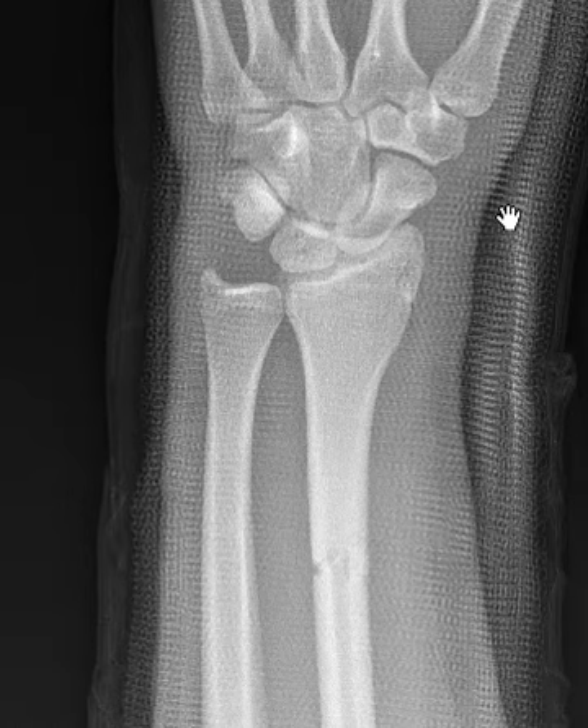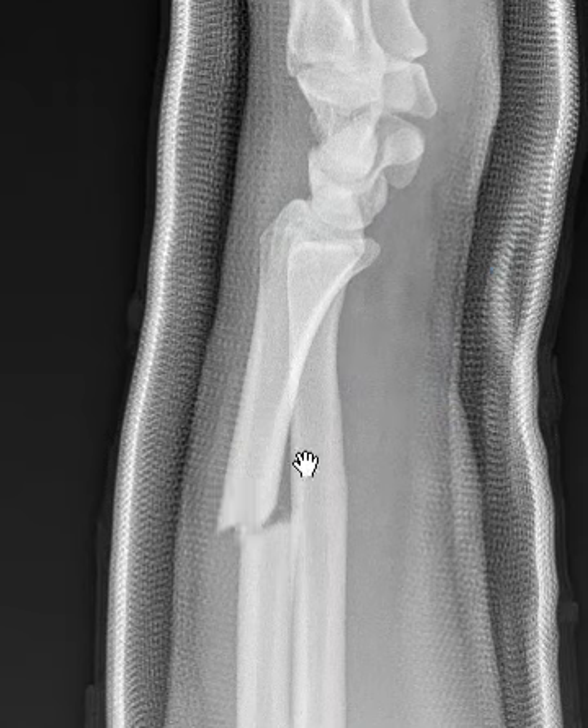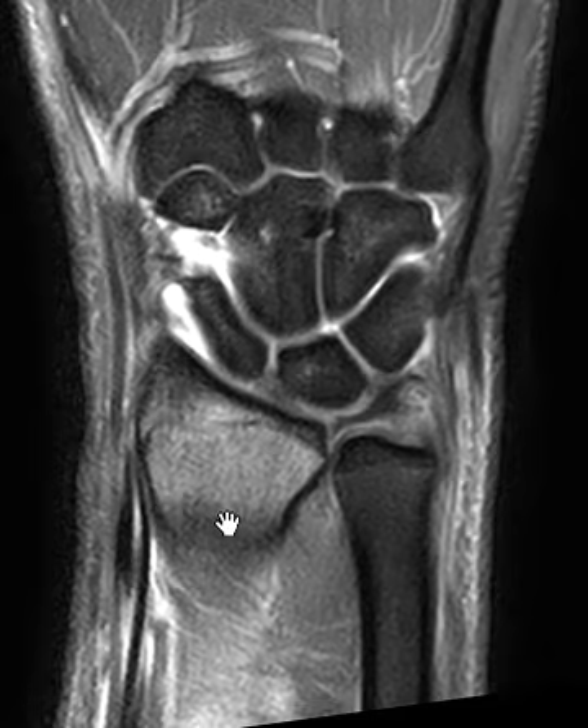Hello, this is Dr. Gay from Forsyth MRI. This is a 17-year-old male who has a fracture of their radius distally — this is the radial diaphysis. On the lateral view they had some bone displacement, and they're having some pain in the wrist as well, and they wanted to do an MRI of the wrist to make sure nothing was going on there.